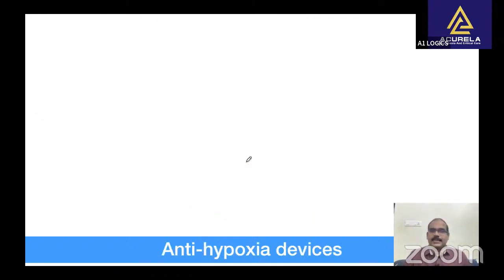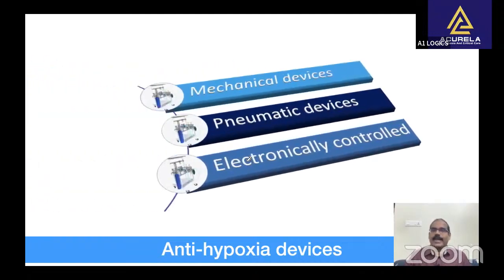Anesthesia machines in use now must either not be capable of delivering a gas mixture of less than 20% oxygen, or have a means to give an alarm at an oxygen concentration of below 20% in the inspiratory gas. The mechanism may be a pneumatic one, mechanical one or electronic one.